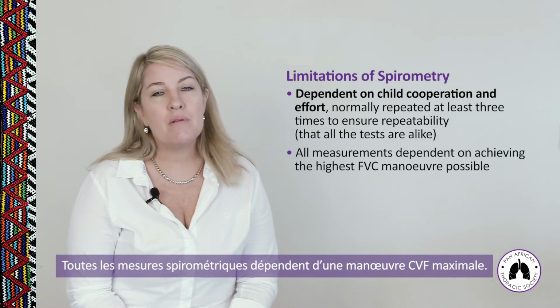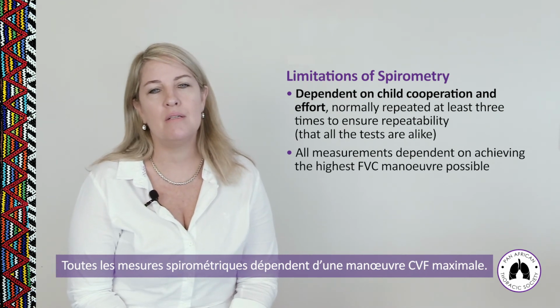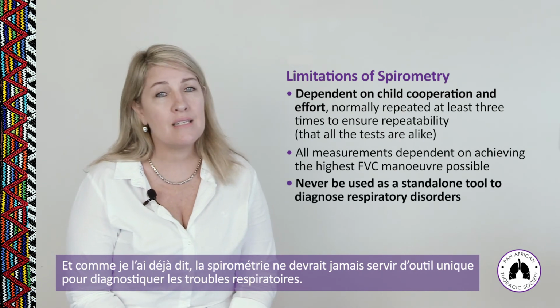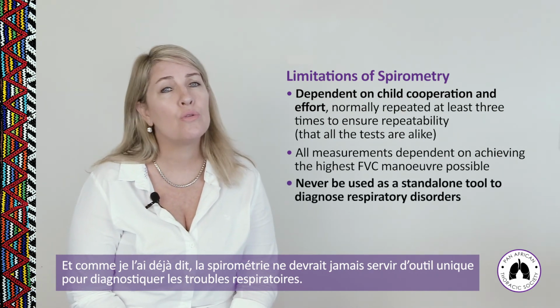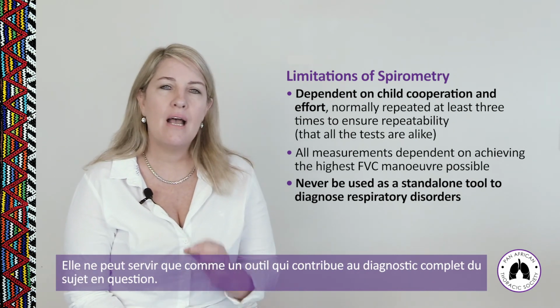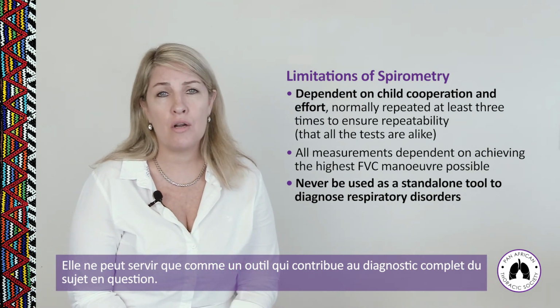All spirometry measurements are dependent on achieving the highest FVC maneuver possible. And additionally, spirometry should never be used, as I said before, as a standalone tool to diagnose respiratory disorders. We always use it as just one tool for making an interpretation on a patient.